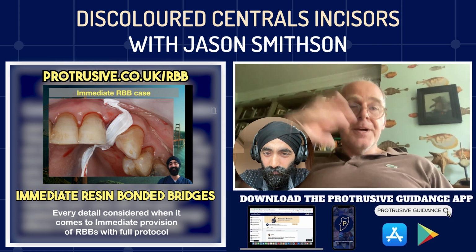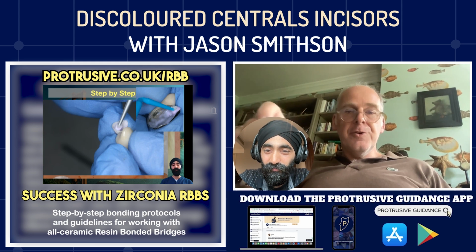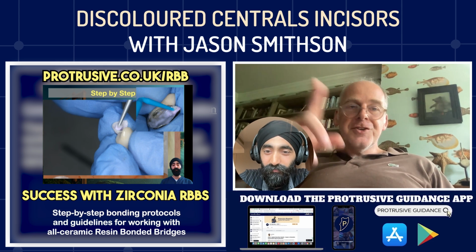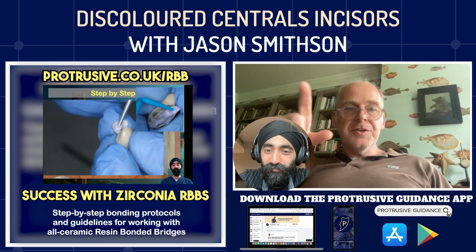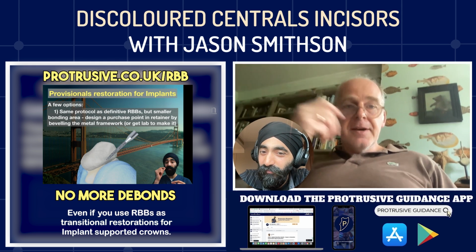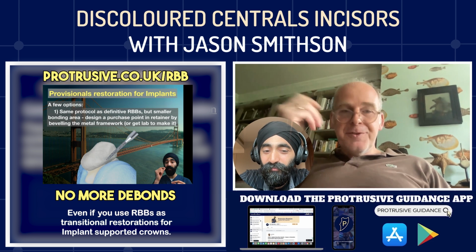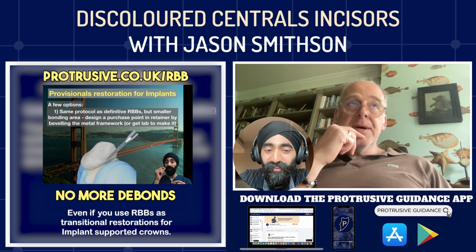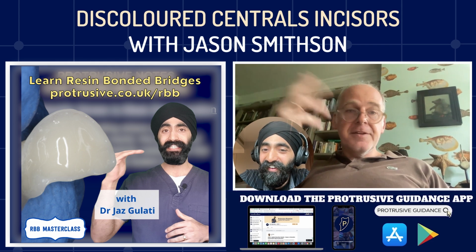And the Tokuyama has been designed for that. So if you take a Northern European guy, I'm presuming of your principal, who has bleached, Tokuyama wouldn't be your first choice. You would be wanting to use a composite resin that's perhaps been developed in Germany, because that might be more relevant for that case. And then you wouldn't have had to mix the white in. So you probably would have been better off with a bleach shade from, let's say, Kulzer or Ivoclar or something like that, rather than the Tokuyama.